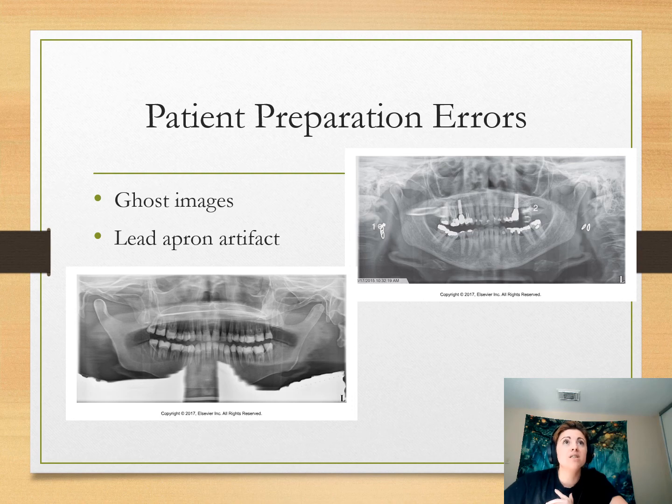That's not good. So we need to have our patients remove earrings, tongue rings, partial dentures, full dentures too, and retainers. We'll have to have them take off any necklaces. We'll have them take out bobby pins from their hair. People have plastic clips. Plastic is okay. Usually that doesn't show up, but the little metal springs that hold the clip together will show up on your x-rays. So you're going to have them take out anything from their hair.